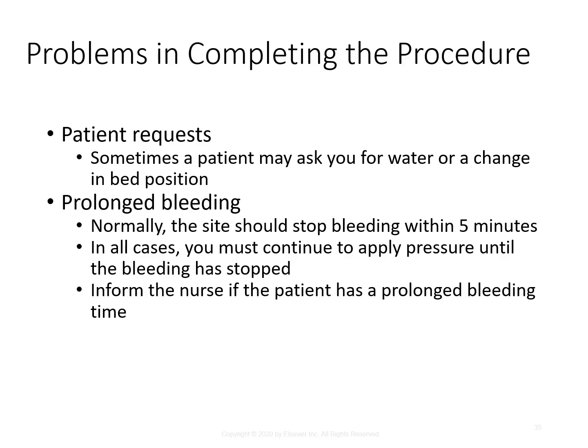Patients can have prolonged bleeding as well. Normally the site should stop within about 5 minutes, but in all cases you must continue to apply pressure until the bleeding has stopped. If for some reason it's taking a long time, you're going to want to inform the nurse as well, because maybe they're on blood thinners, so maybe they need pressure held on that a little bit longer. Failure to apply adequate pressure, particularly with patients on those blood thinners, can cause compartment syndrome, which we will talk about later.